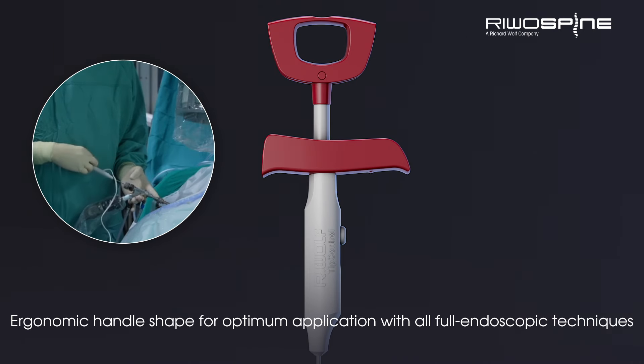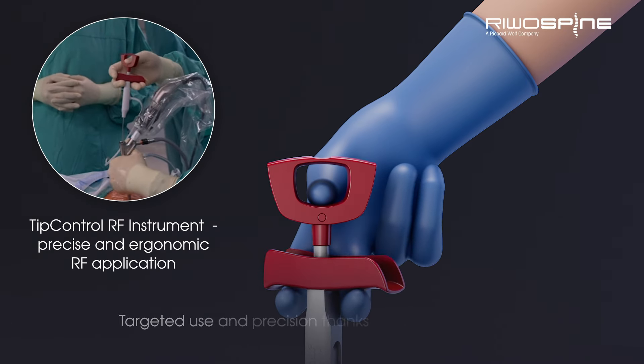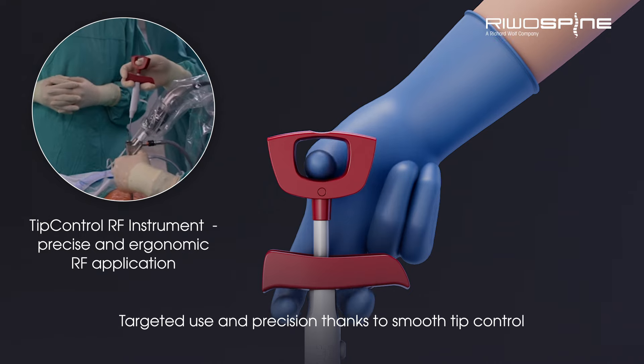Ergonomic handle shape for optimum application with all full endoscopic techniques. Secure hold for the instrument with thumb ring guide. Targeted use and precision thanks to smooth tip control.